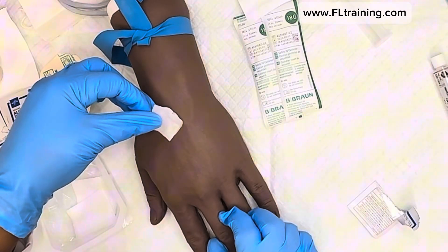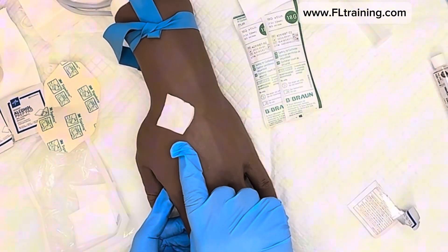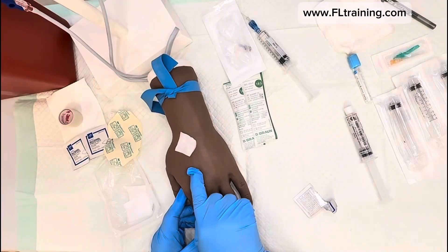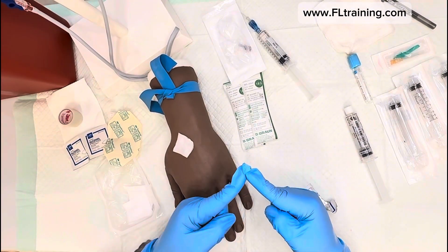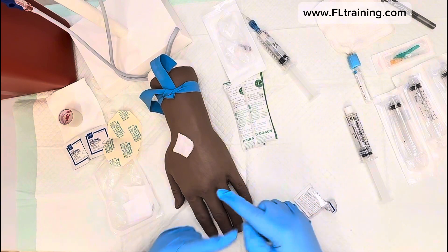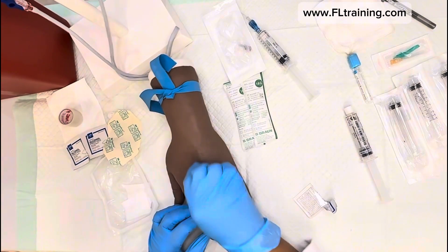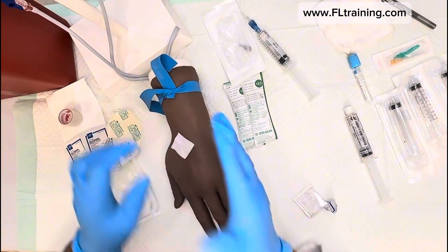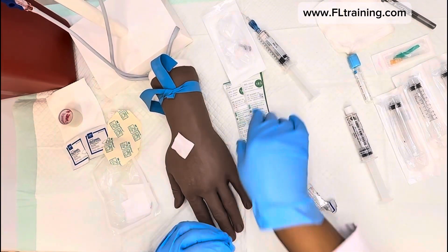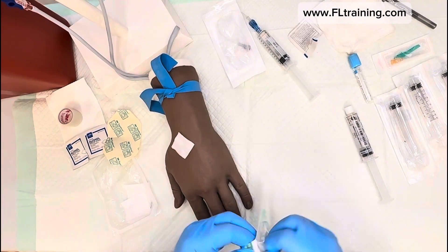As the alcohol evaporates, you may forget where the vein is. Remember that veins are spongy — if you find something hard, nodular, or the vein splits (we call that a bifurcation), you want to avoid that area. Let me clean again — I've had the tourniquet on for more than 60 seconds, but my patient forgives me.